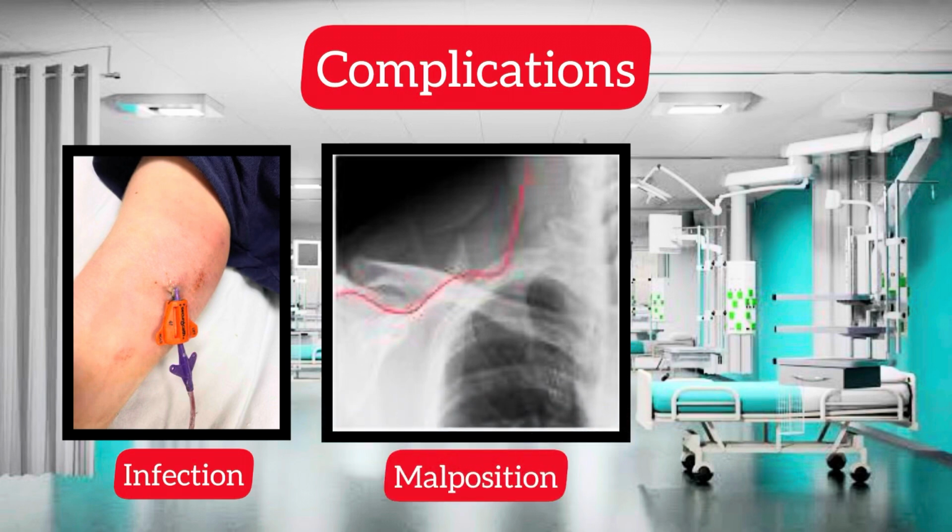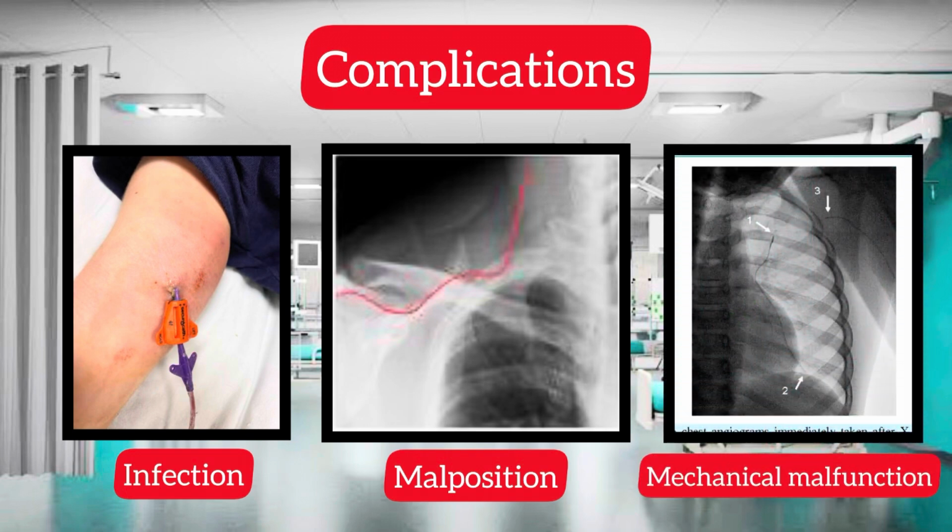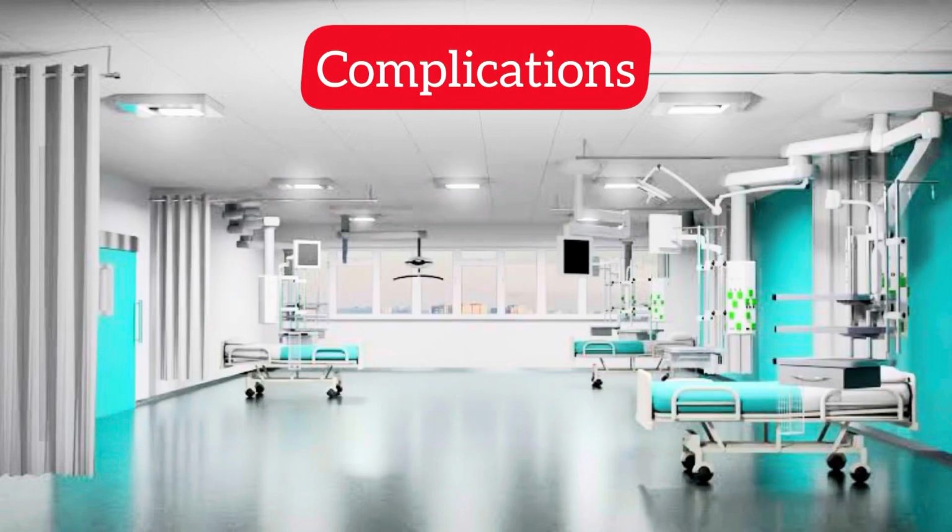Catheter malposition or migration. PICC malposition is common. They can be misplaced in the jugular vein, brachiocephalic vein, or azygos vein. Causes include vascular abnormalities, a patient's position during insertion, or changes in venous pressure inside the chest if a patient coughs or vomits. Mechanical malfunction. Another major complication is device malfunction, with anywhere between 10% and 27% of PICCs developing mechanical failure.